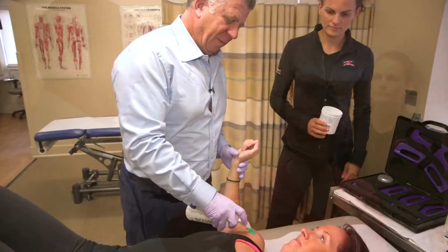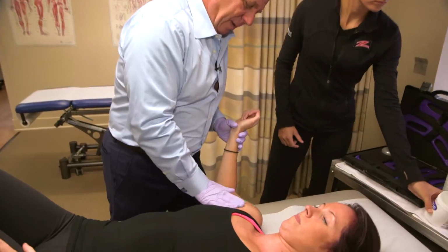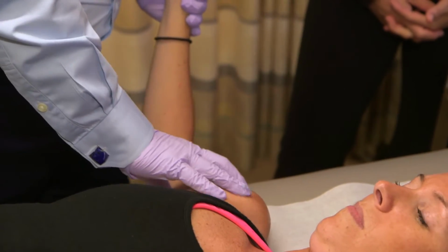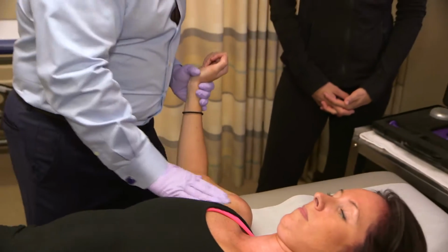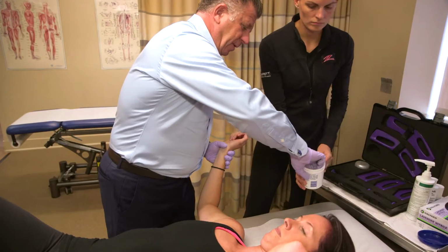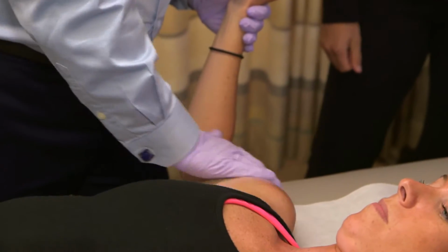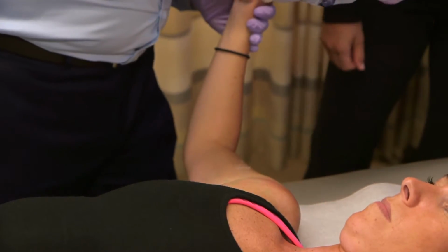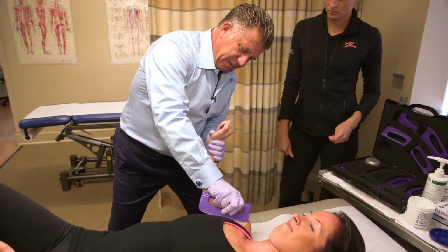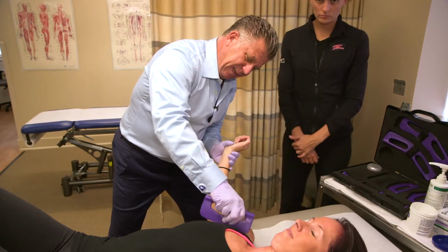in the muscle. We'll start out applying some Biofreeze, which is a muscle rub which will take care of some of the soreness, diminish some of the soreness. I like to apply that first right onto the shoulder. Then we put the lubricant. That's great. Let me have the tools. Okay, this is one of the larger tools, and we're going to start going over the bicep tendon.